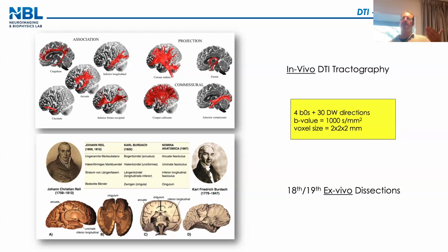Although we can have a chat discussing tractography unions versus fMRI unions. I'm from the diffusion union, so I find it really unfair that for fMRI you dedicate 20, 30 minutes of experiment, and for diffusion, no more than 5. So I'm always proposing 10, 15 minutes also for diffusion. If you want to have a debate, I'm here. But anyway, 5 minutes is usually a kind of typical limit for diffusion, but if you can do 15, 20, I can tell you the benefits are there.